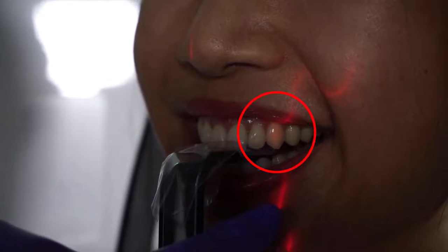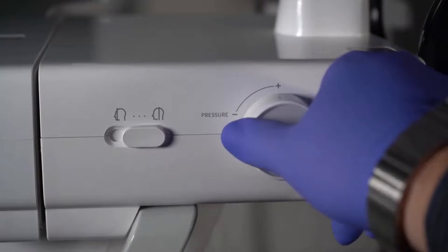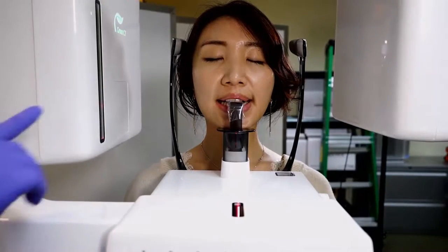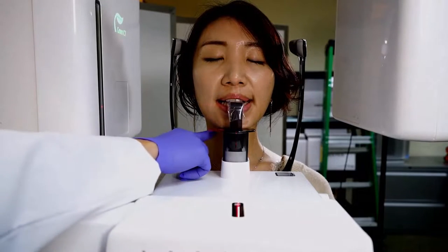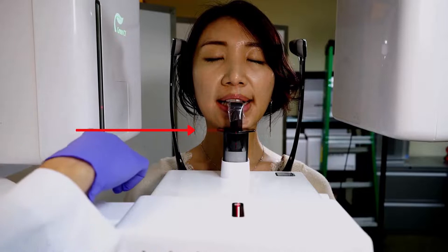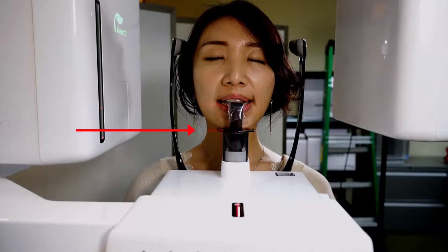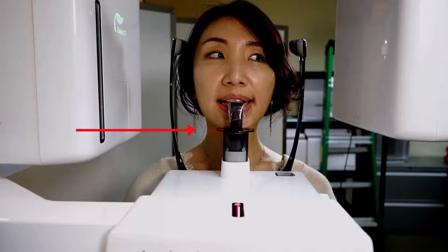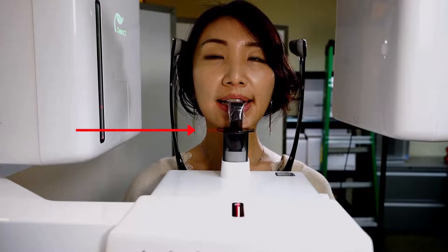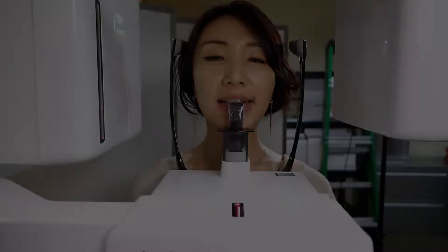To ensure patient stability, turn the temple rod dial to secure the patient. Note the Green X12 has a new horizontal laser beam to proactively identify and ensure clearance for the patient's shoulders. If the beam is projecting onto the patient's shoulders, the operator will need to make patient adjustments to allow clearance for the bottom of the rotator.